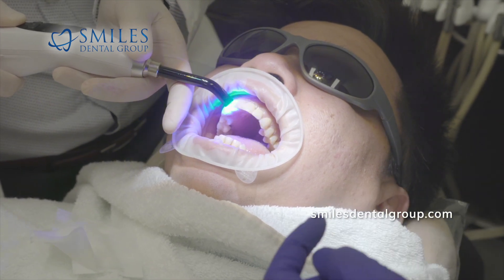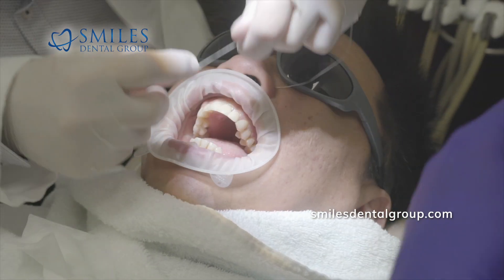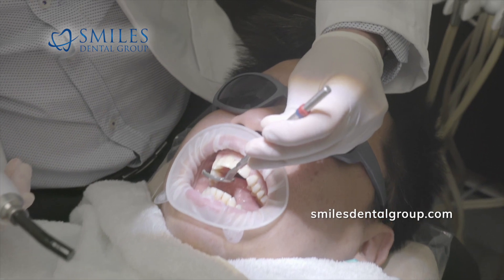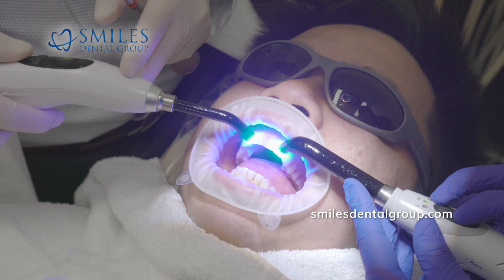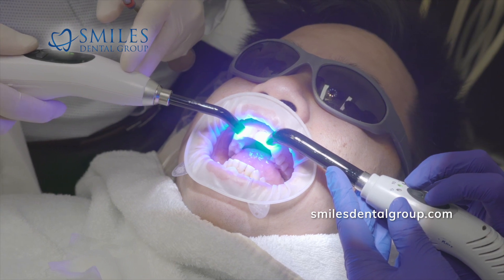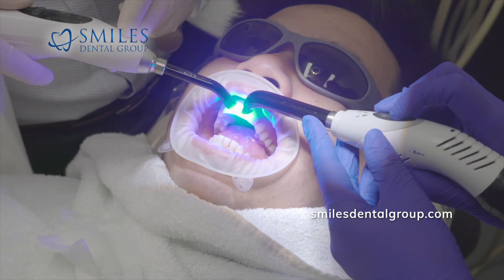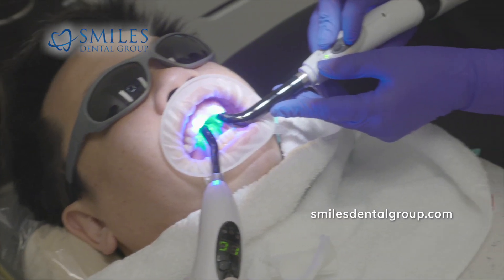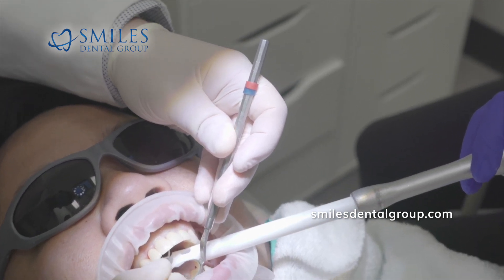Now we're getting ready for the final cure. I'm doing the flossing step one more time, making sure we can floss in between the porcelain restorations. When we're happy with everything, we do the final cure — the assistant and I will each have our own light curing device. We'll do 10 to 15 seconds per tooth on the buccal or facial side and then again on the lingual side. I'm just cleaning off any excess cement.